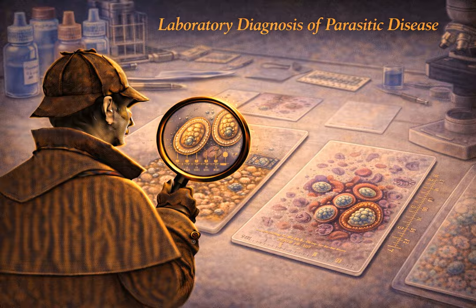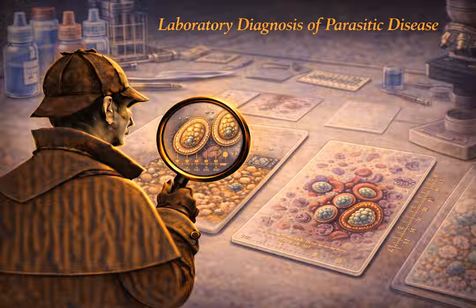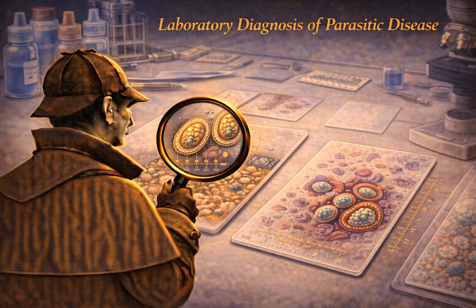Right. Sedimentation is the reverse process. You use ethyl acetate to dissolve away the fats and the fecal debris, and then you centrifuge it hard. So the heavy parasites are driven down and end up concentrated in a tiny pellet at the very bottom of the tube. Honestly, sedimentation is generally the preferred method globally because it reliably recovers everything. Flotation can actually miss some of the heavier eggs, like Schistosoma, which will just sink right to the bottom and be missed. Okay, so now we have our concentrated sample. We have effectively found the needle in the haystack.